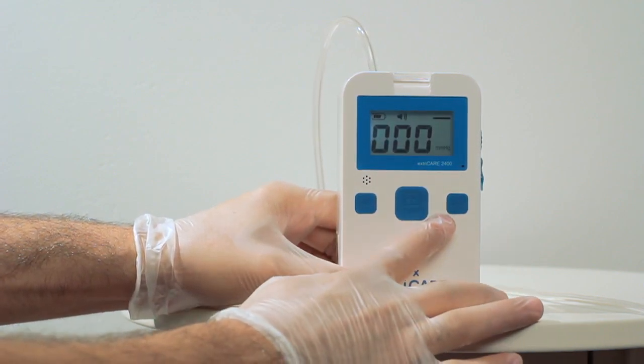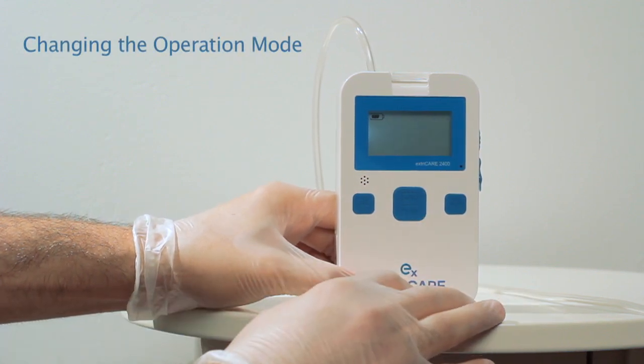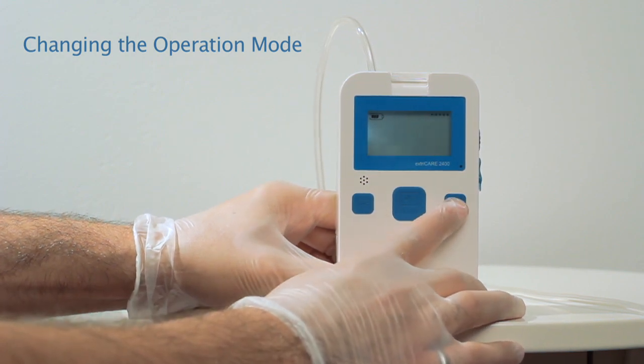To change the operating mode, hold down the MODE button until you hear a beep. After the beep, press the MODE button to change between continuous and intermittent mode.